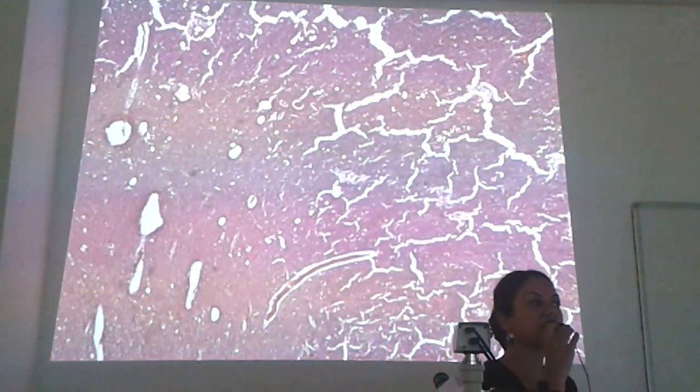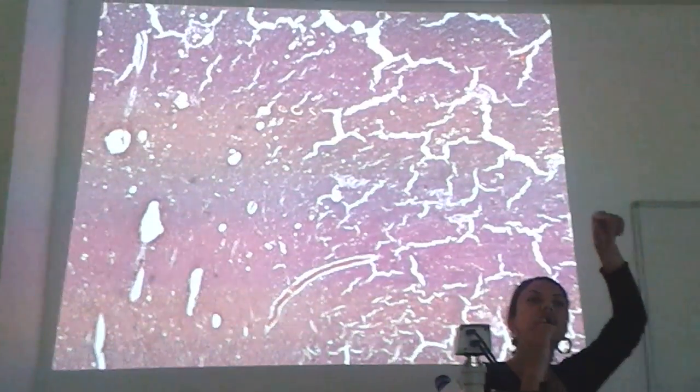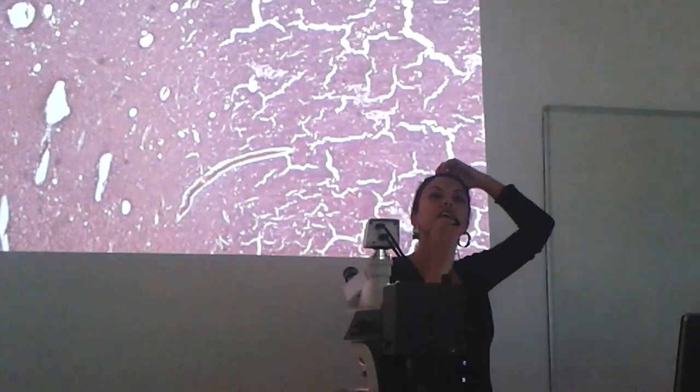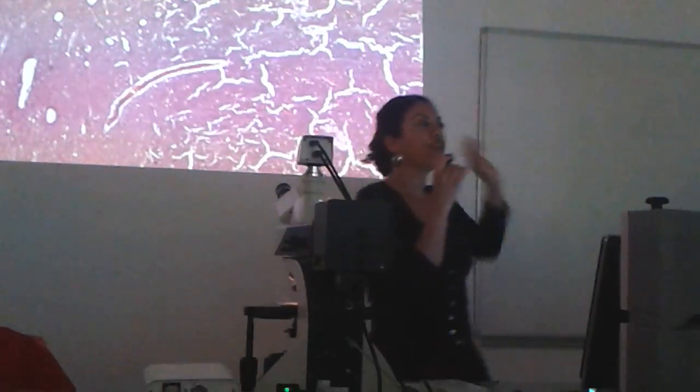Today we are going to study the central nervous system. Can everybody hear me comfortably? The back seats, can you hear me? Yeah? Alright, today we have only 3 slides.